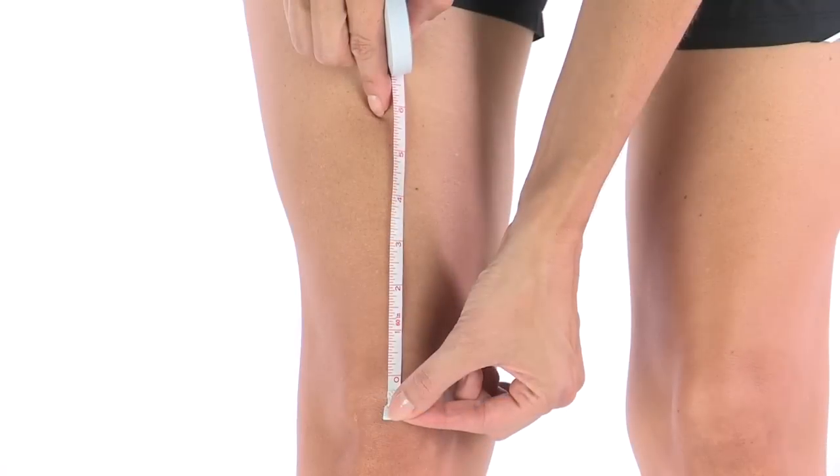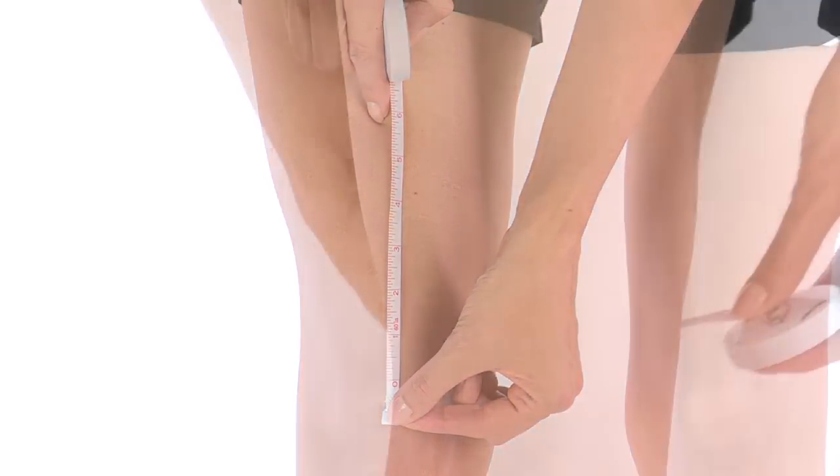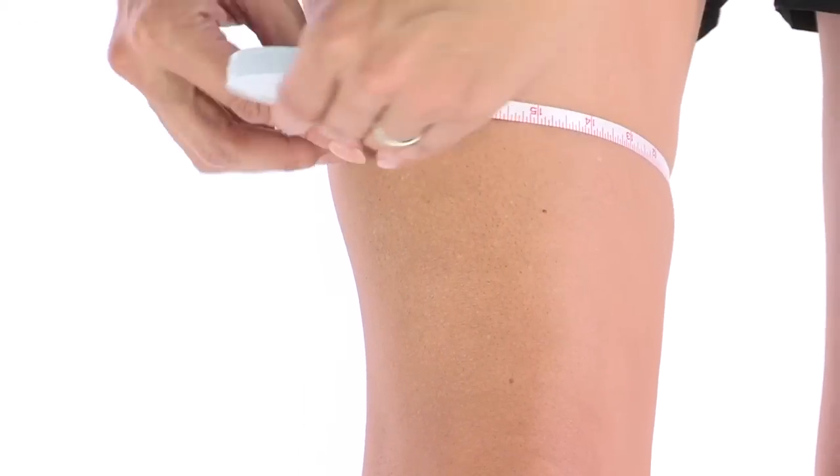To determine your reaction knee brace size, find the spot six inches above the center of your knee, then take a measurement around your leg, like so.